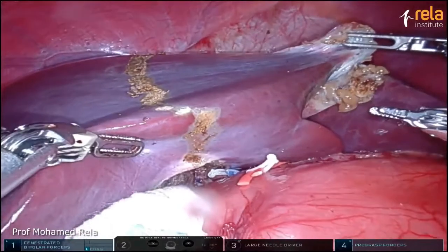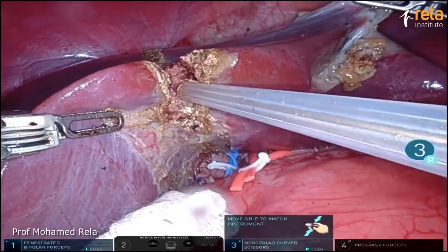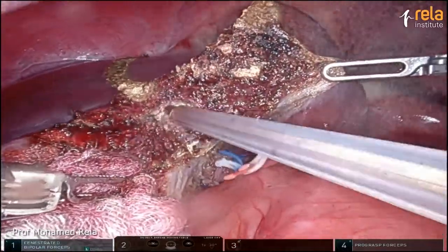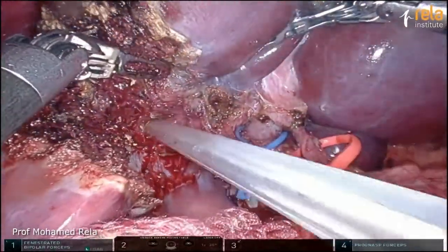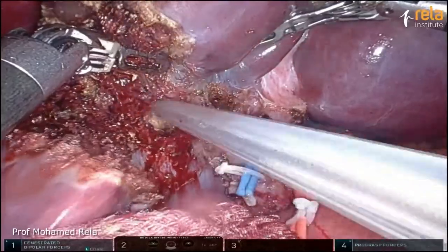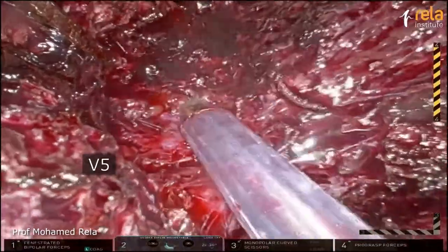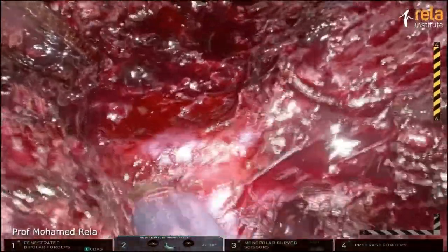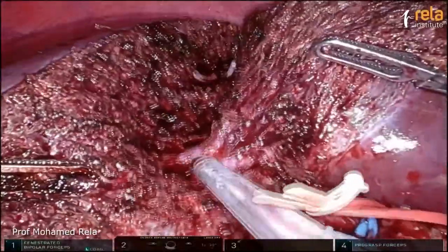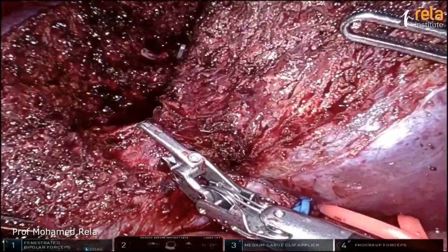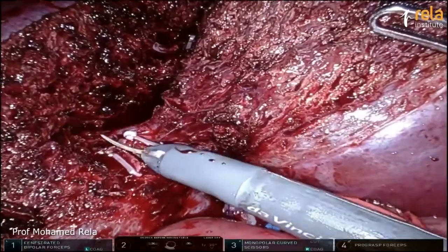The bedside surgeon is going to do the parenchymal transection using the CUSA. This is our preferred method, even though we have used the robotic harmonic in some cases. This requires an experienced bedside surgeon. Rajesh is one of our surgeons who does most of this work. That's the segment five branch draining into the middle hepatic vein — there are two of them, so we've taken them separately.